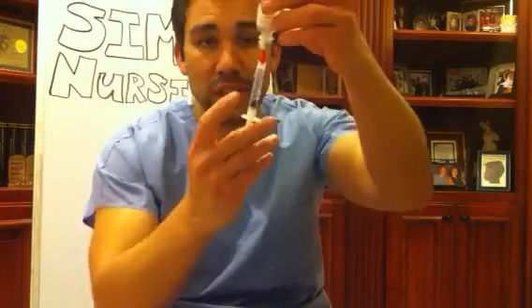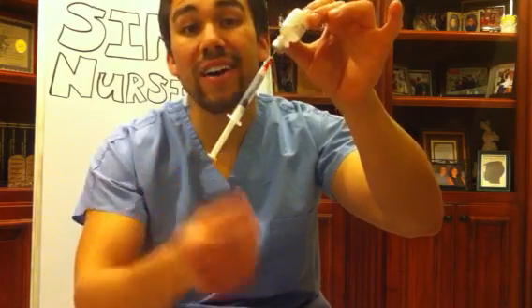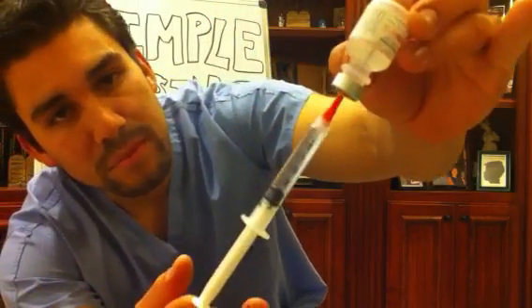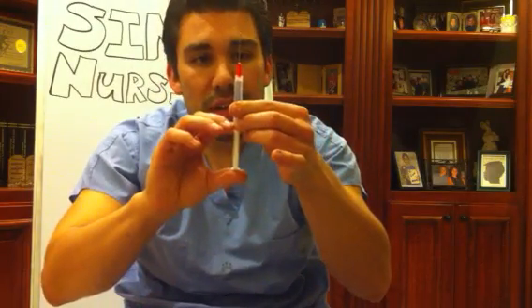Push the air into your vial, then bring your blunt-end syringe down and pull back. Some nursing instructors will get on you if you touch the inside of the syringe, so just use the end of the plunger. You're pulling up 2.5 mls. Check your vial, then label your drug — make sure that if you drop it on the floor, they know what drug it is.